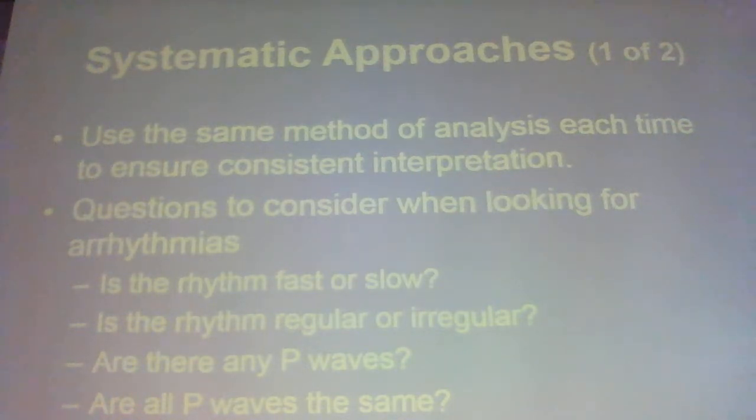So, what is significant? It has to be in two or more anatomically contiguous leads. So what does that mean? It means that it looks at the same or adjacent piece of heart muscle. So if I said I'm going to give you a free round trip ticket to anywhere in the contiguous United States, can you go to Hawaii? Can you go to Alaska? No, because they're not connected, right?